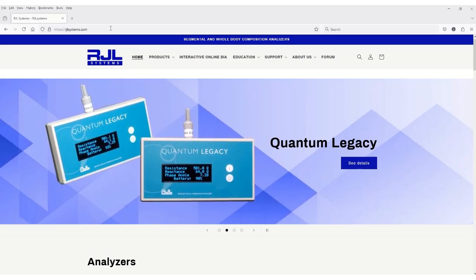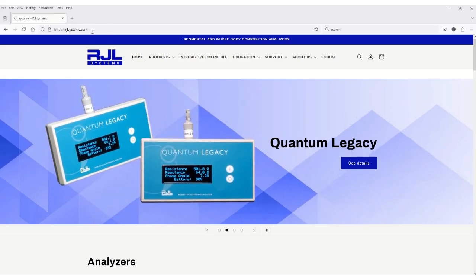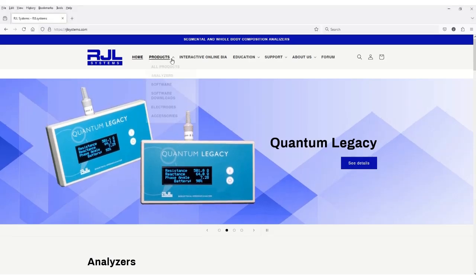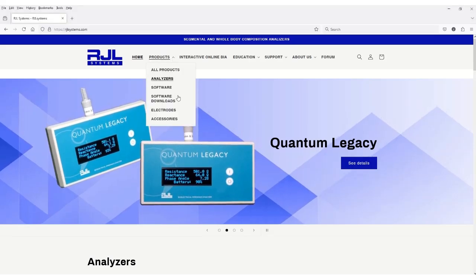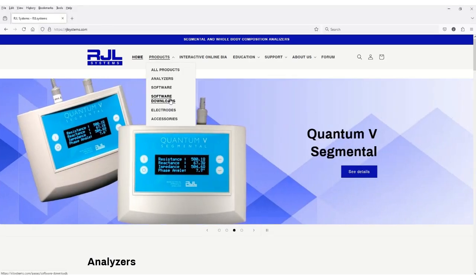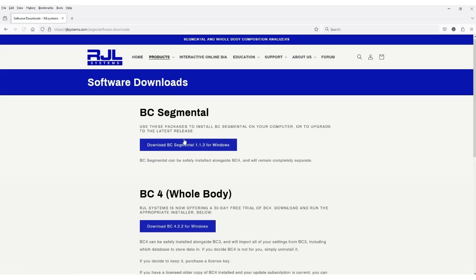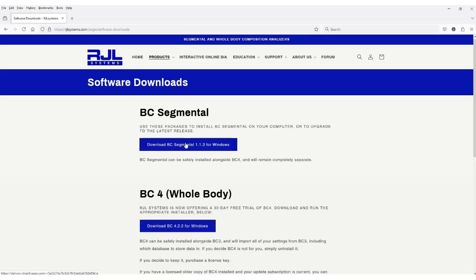First navigate to rjlsystems.com, go to Products, and then Software Downloads. Here you will find our BC Segmental software for use with the Quantum 5 and our BC4 whole body software for use with all RJL Systems products.